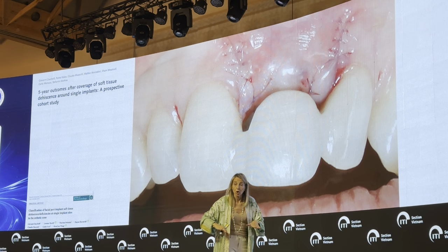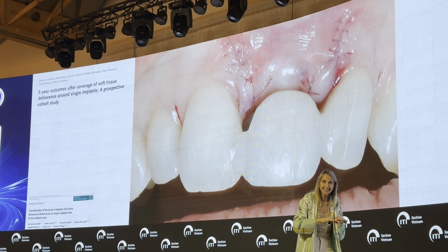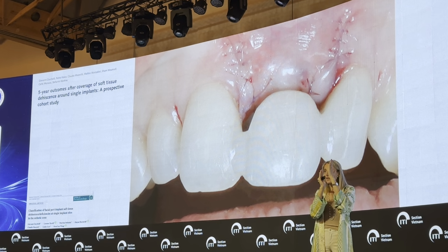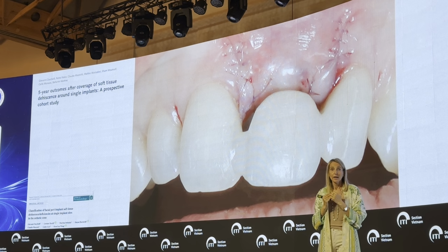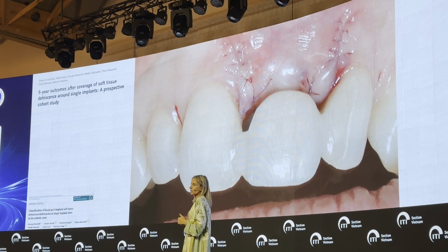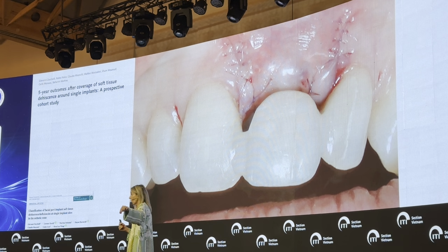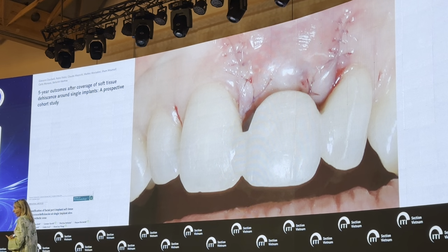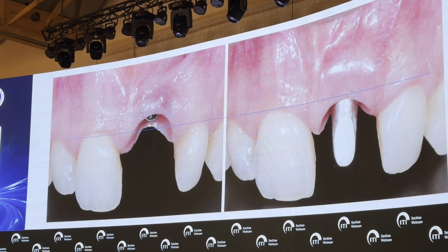And I'm capable to coronally advance the flap, verticalizing a flap that derives from the alveolar mucosa of the lip, verticalize, and then coronally advance the flap. And at the end of the surgical procedure, I have 8 millimeters of vestibule depth, starting from 0. So I'm not reducing the vestibule depth, I'm creating the vestibule depth with the coronal advancement of the flap, removing all the muscle insertion from the inner aspect of the alveolar mucosa.